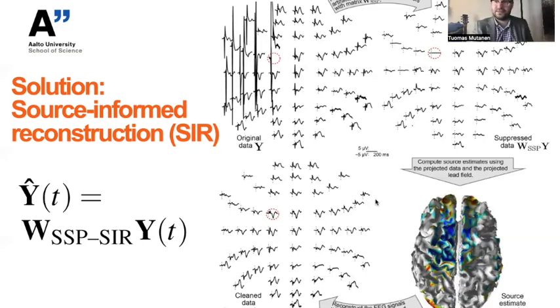And this seems to work quite well. In the end, we have a very simple spatial filter that defines our clean signals in terms of the original signals. Although you can see here the logic that led to this very simple equation.